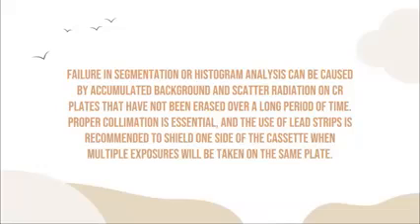And if you are going to use two views sa isa ka imaging plate, as I have mentioned sa midterm, dapat diliingan ang practice, kay katong naay area in the middle of the views na mag-cause og artifact. So, ma-apply to siya direct. So, ang buhatan ninyo is, buhat og lead strips sa first ninyo na exposure so that dili ma-apektuhan ang inyong first exposure. Because ma-absorb man sa lead strips ang inyong scatter radiation. Therefore, minimize ang production of scatter radiation on the first image when exposing the second image on the same plate. Okay?